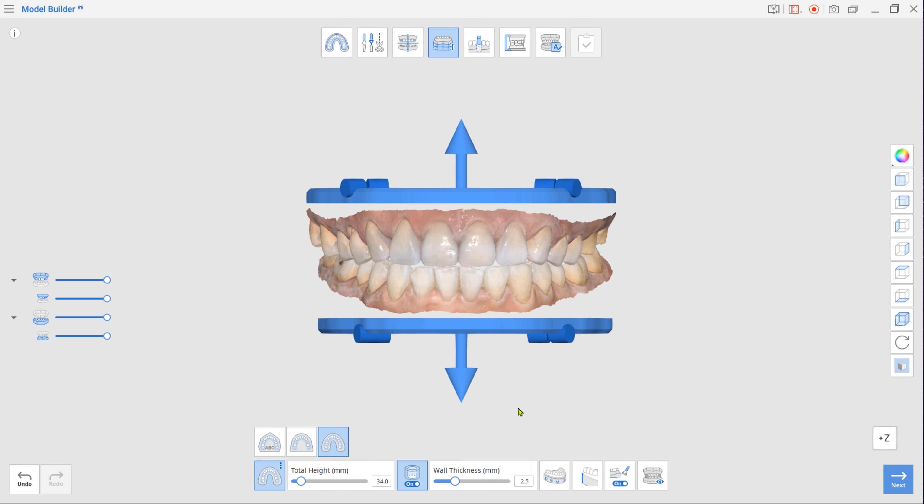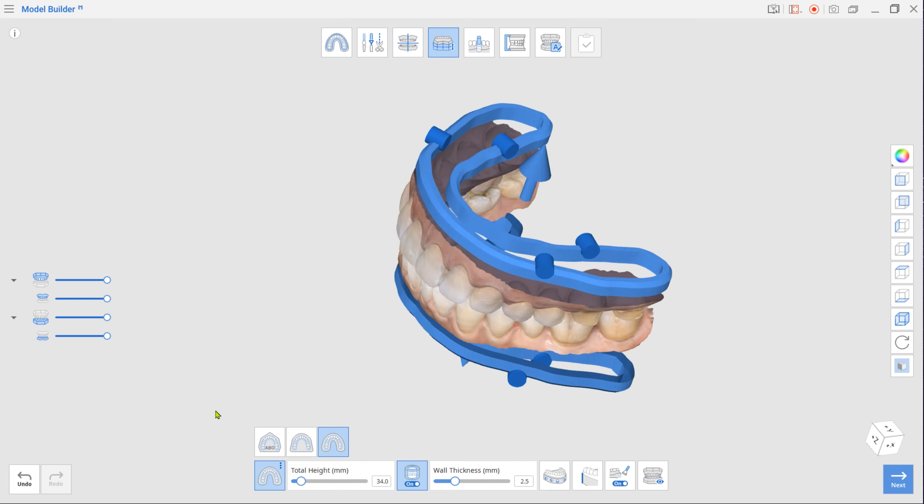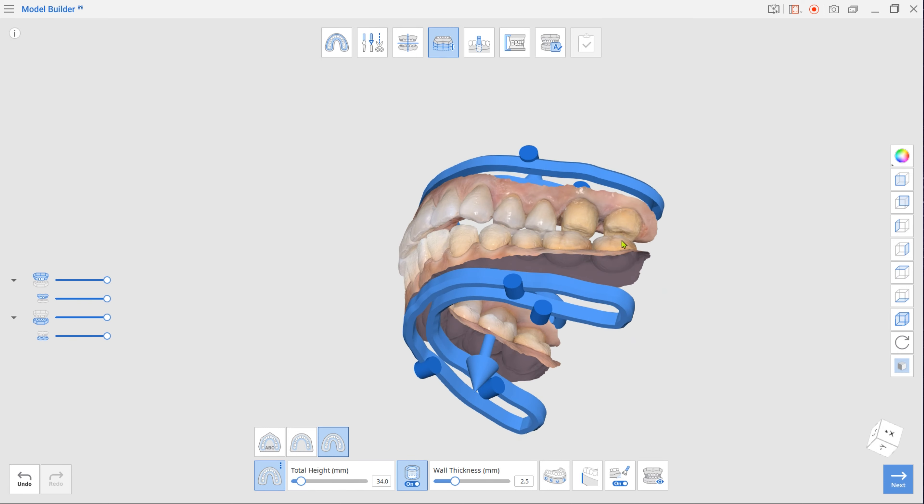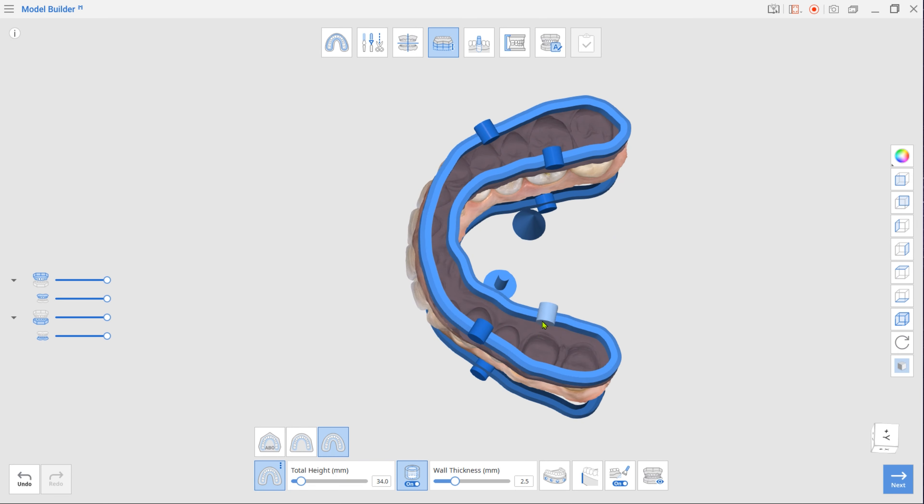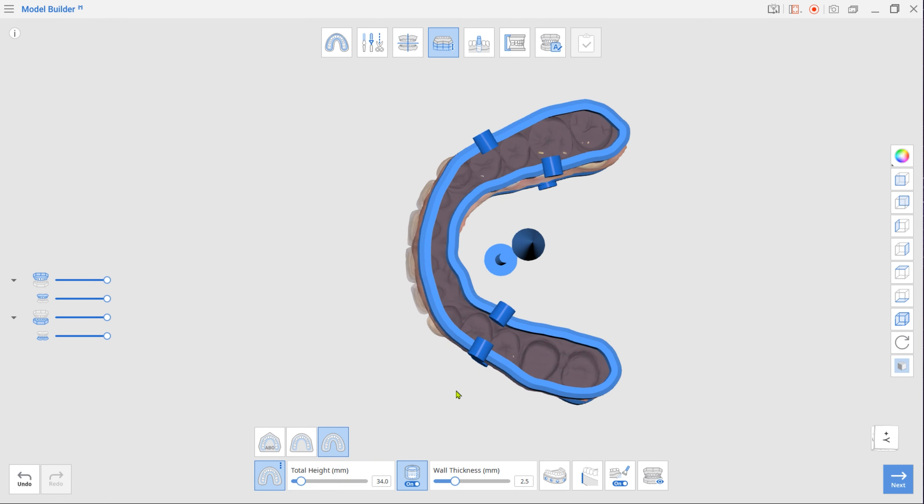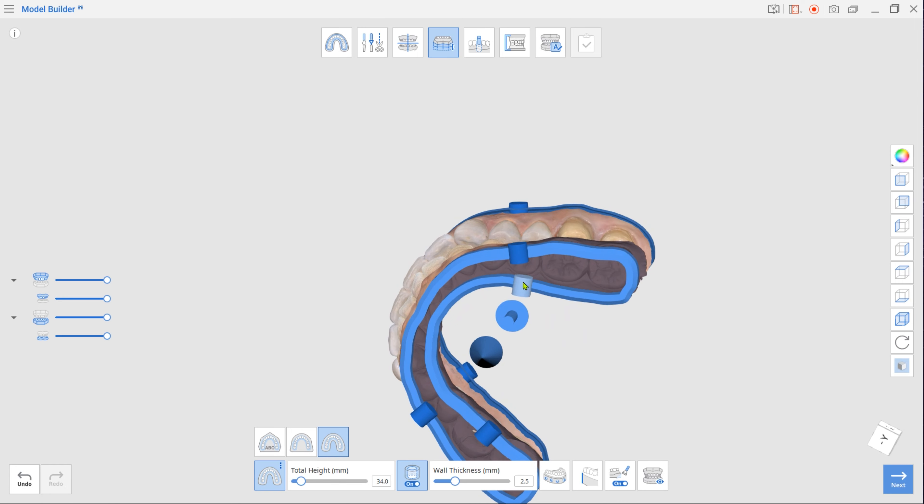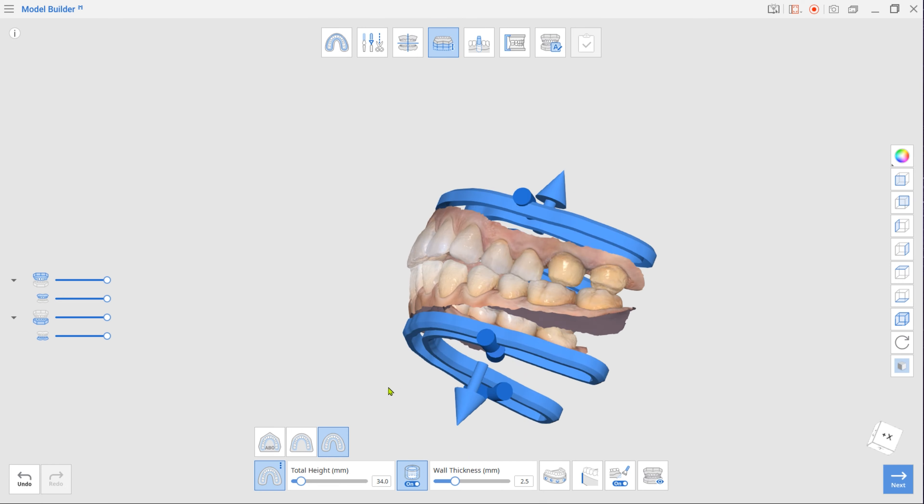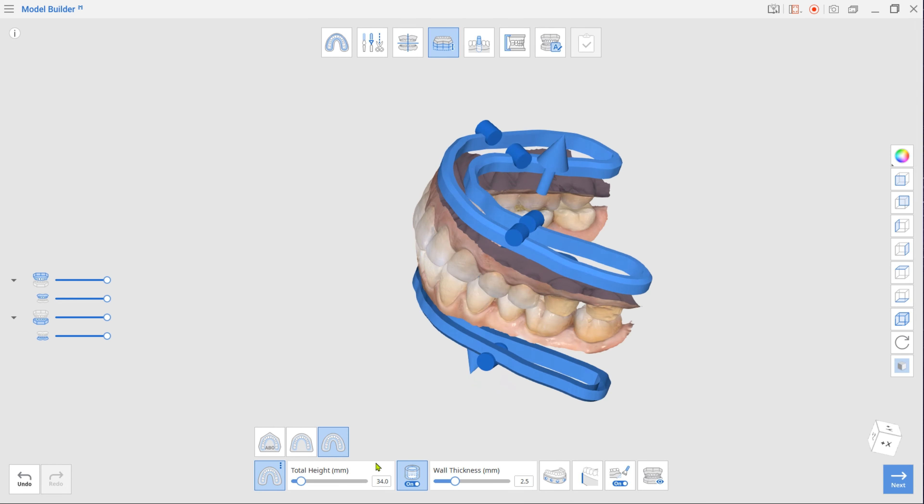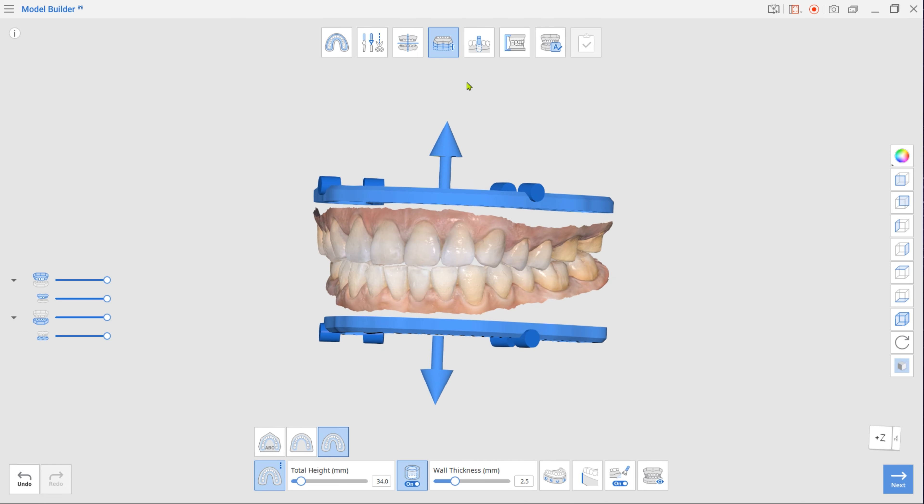Create drain holes and ensure they are not placed near your working dies. Adding drain holes will prevent blowouts caused by cupping. When done, move to die creation mode.